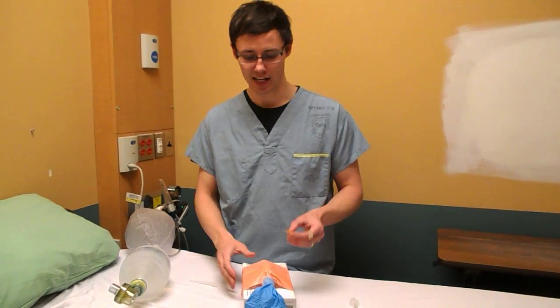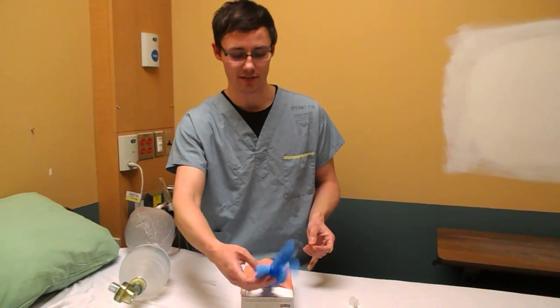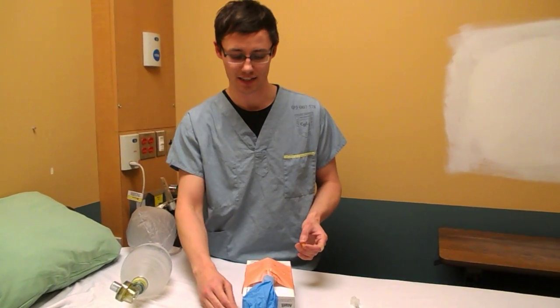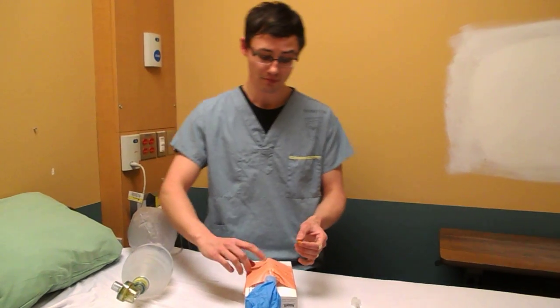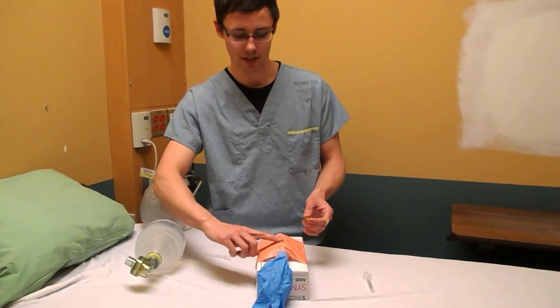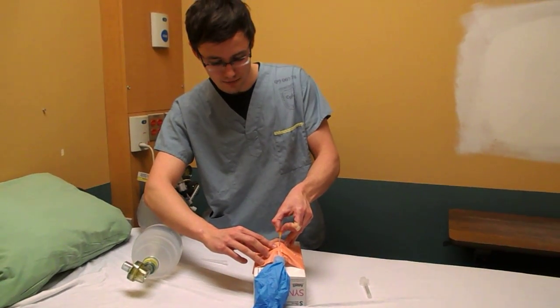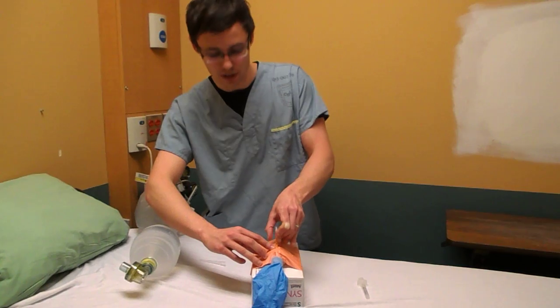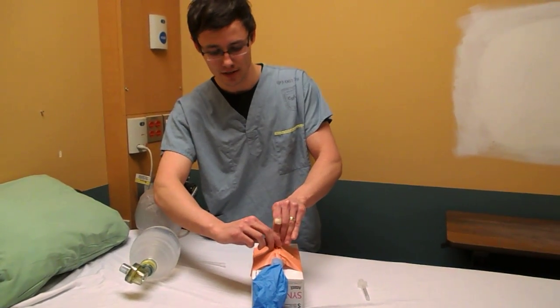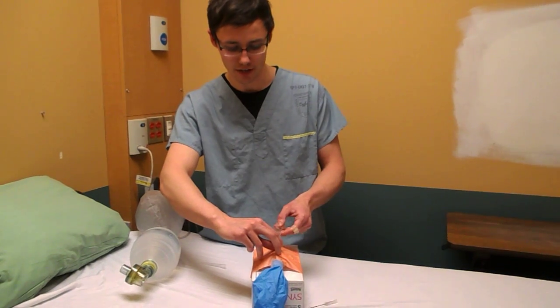Take your 14 gauge catheter and landmark for your cric. You'll also notice I've attached a glove to represent lungs — pretty high tech stuff. Landmarking for your cric: thyroid cartilage, cricoid cartilage, cricothyroid membrane in between. Insert your needle, feel it go through the tracheal rings, then remove your needle. Now you have your catheter attached.